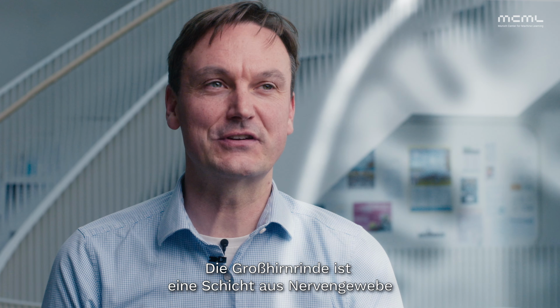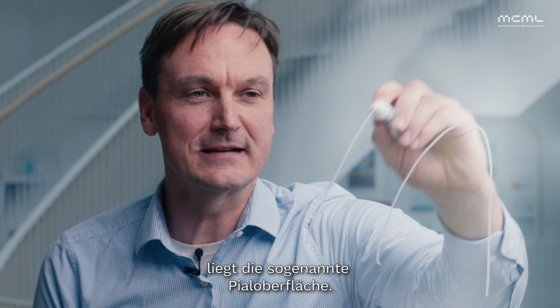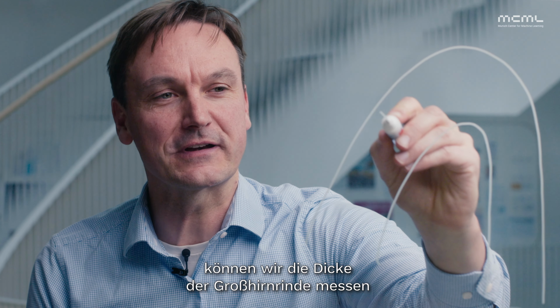The cortex is a sheet of neural tissue that has two boundaries. On the inside, we have the white matter surface, and on the outside, we have the pial surface. Now, if we have both of those surfaces reconstructed, what we can do is measure the thickness of the cortex that is shown by these arrows here.